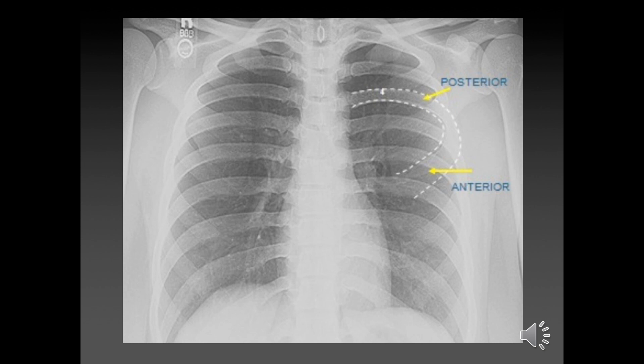It can be quite difficult figuring out which rib is posterior and which is anterior. On a PA film, the posterior ribs would be more prominent. But ideally you would use the anterior ribs, because they are closer to the diaphragm and are a more reliable measure of adequate inspiration — posterior ribs vary a bit more. Counting the anterior ribs: one, two, three, four, five, six.